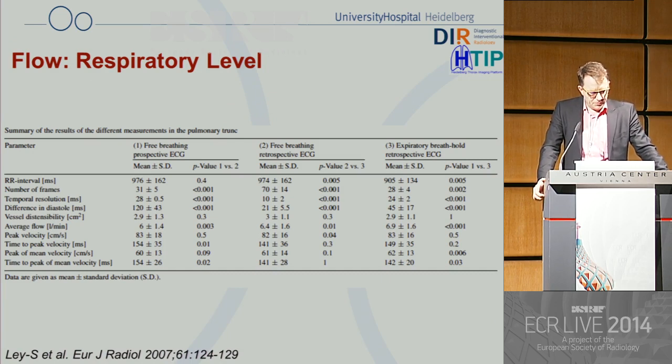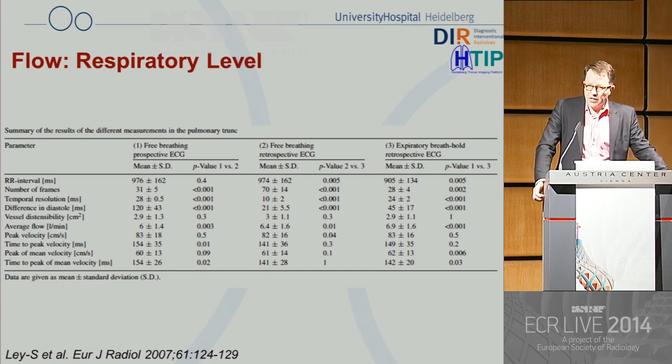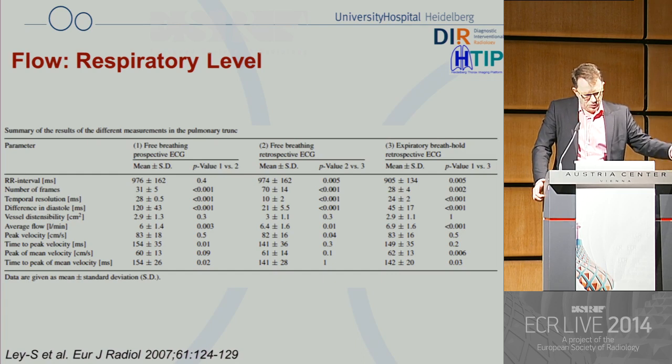It's another work where we were looking at the blood flow and compared free breathing with prospective ECG gating, free breathing with retrospective ECG gating, and expiratory breath hold imaging using ECG gating. And when you look at the flow, for example, the flow is higher in expiration than in free breathing.